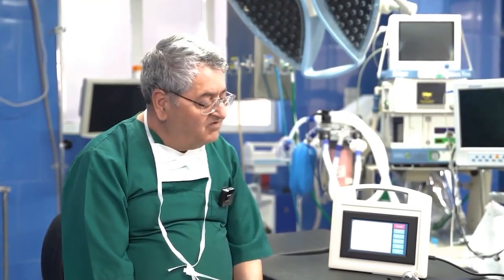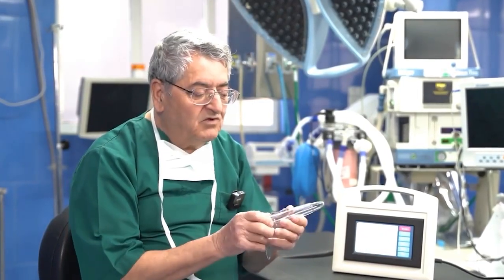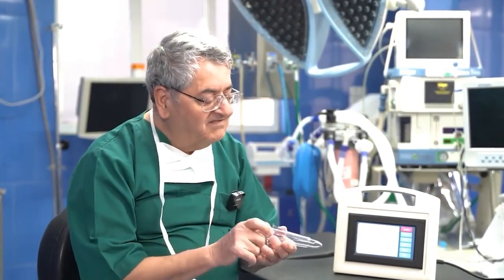Each of these methods requires specific devices, consumables, and the main system itself, making them costly. When I compare this to hemorrhoid electrotherapy, which is a basic method and not expensive, it also does not require consumables. In fact, we use an anoscope and an electrode, and it does not require any special consumables and is not costly.